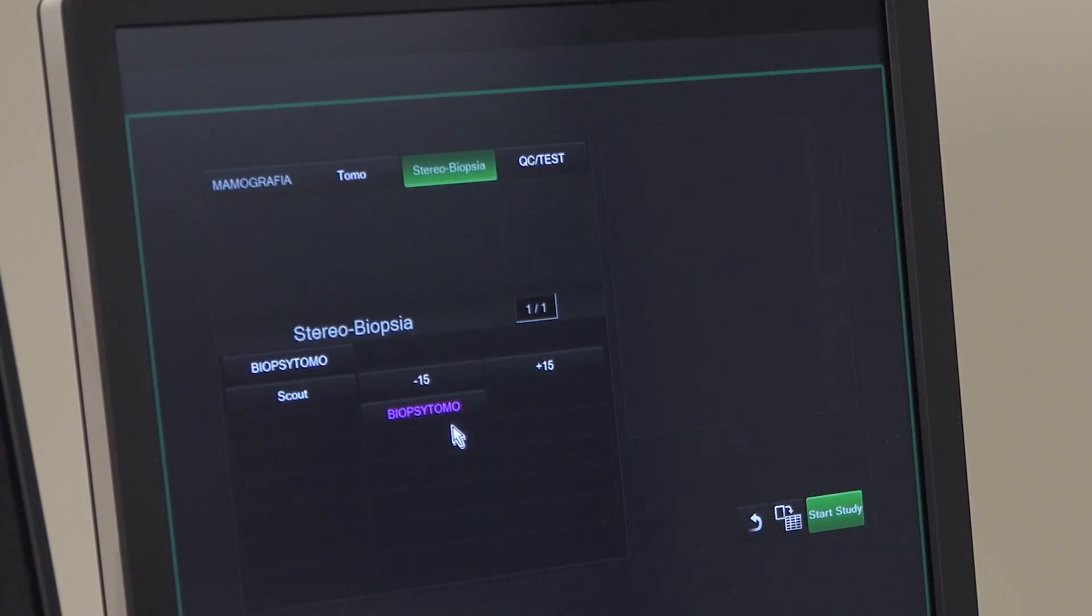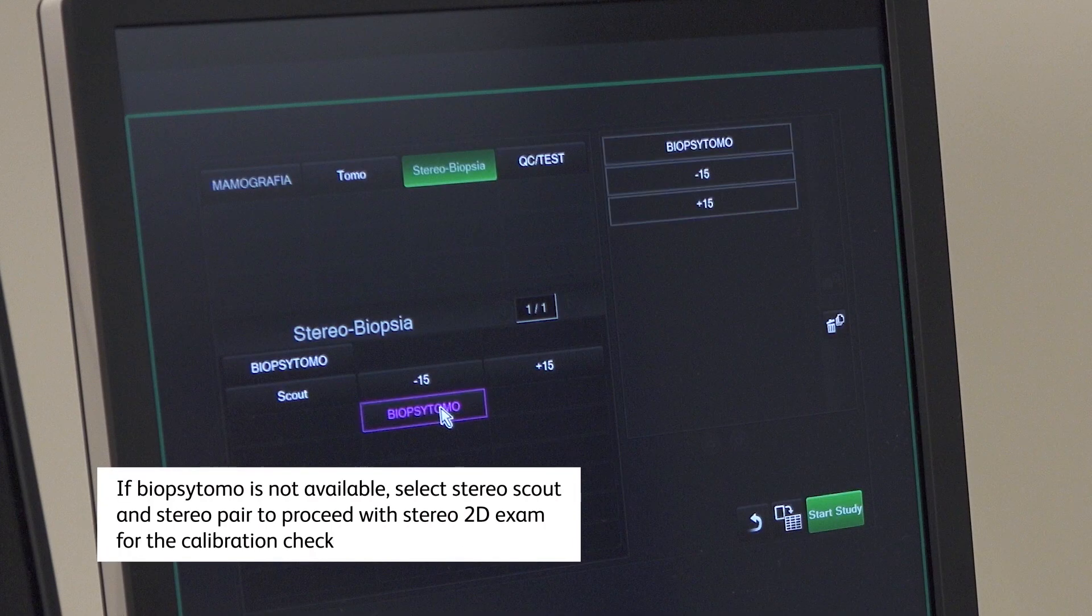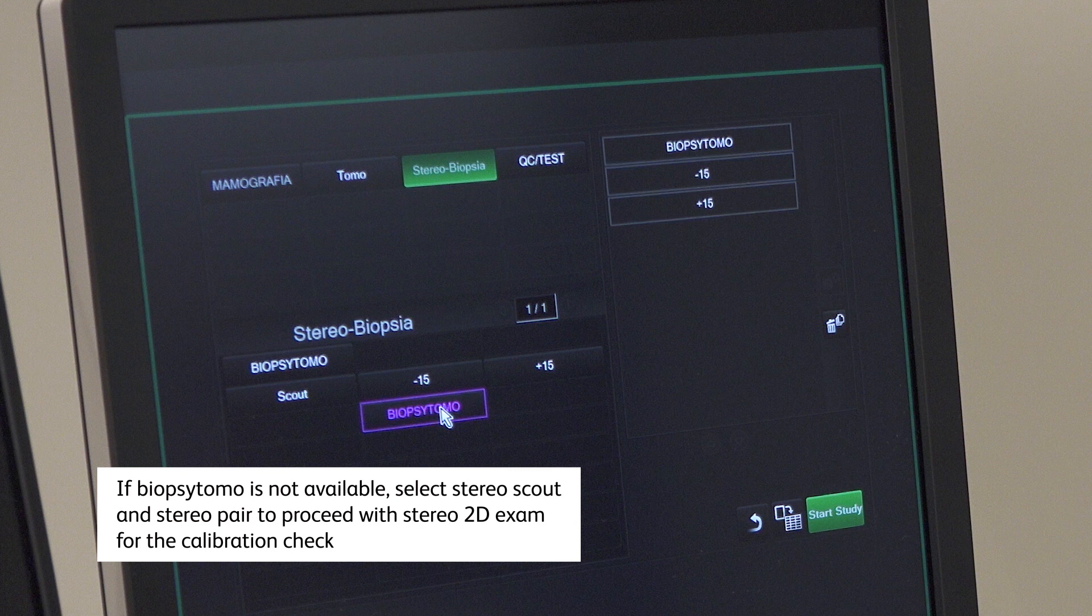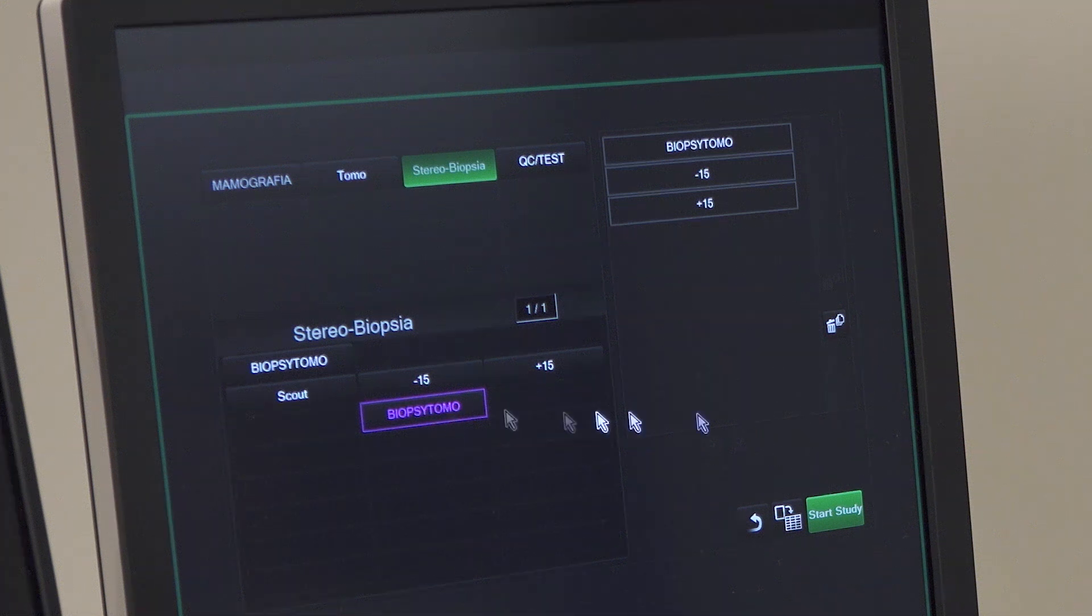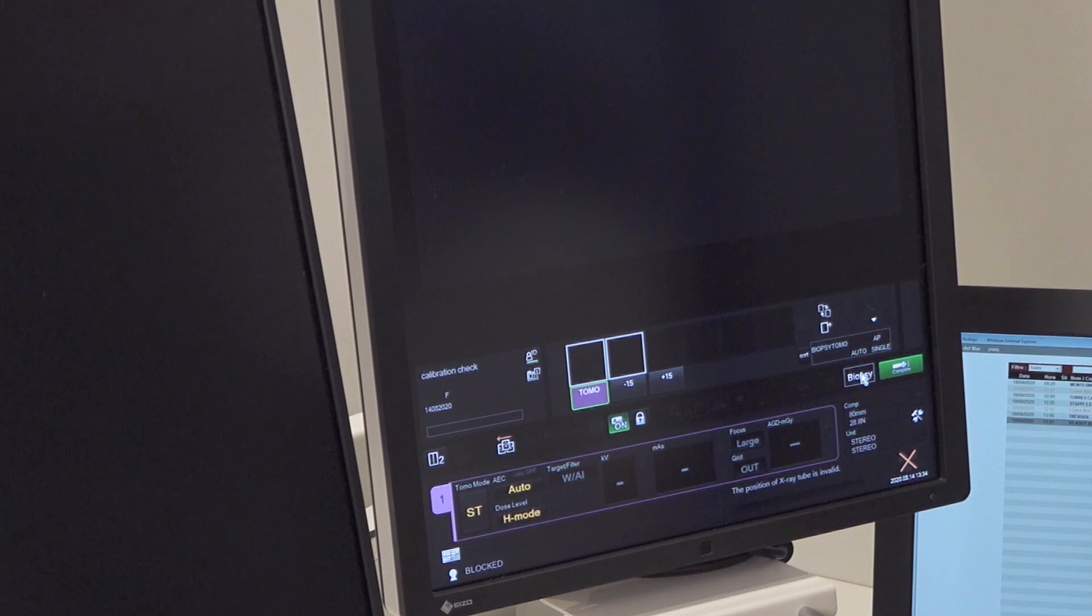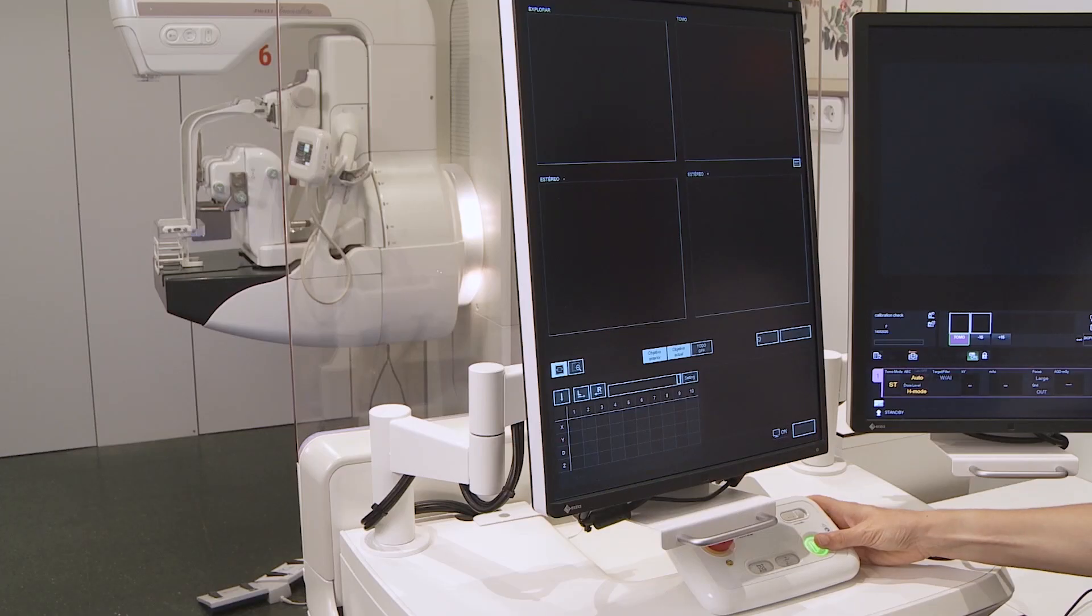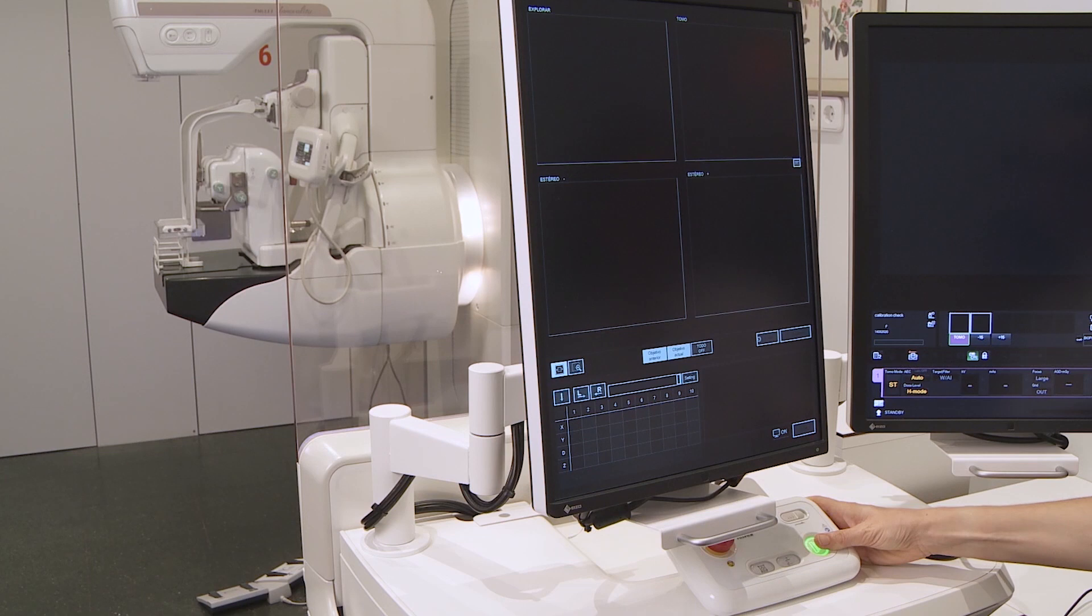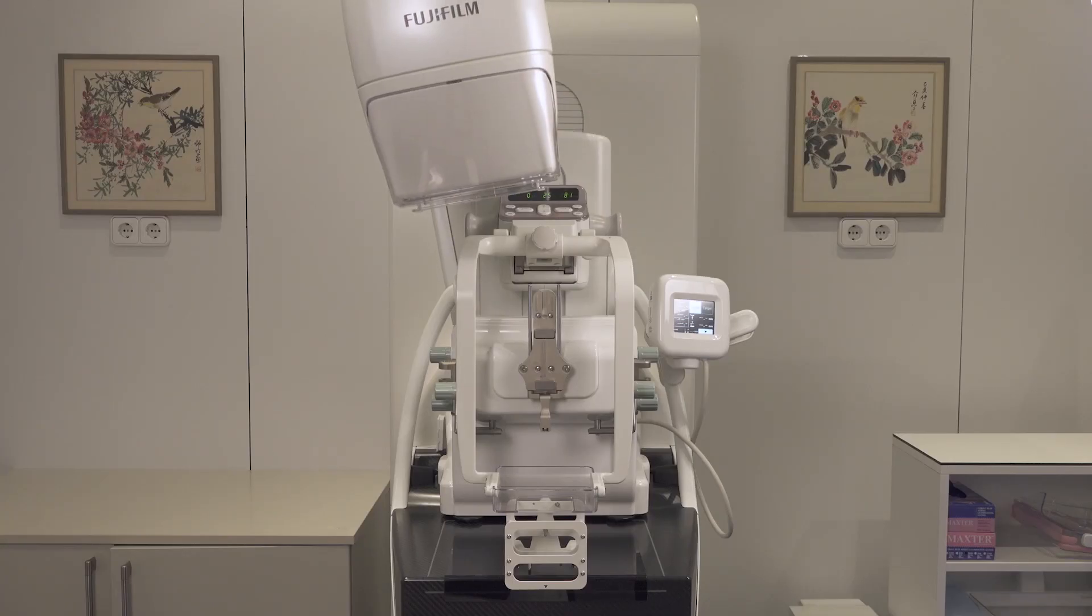Select a biopsy tomo exam. Once the study has started and the biopsy button has been clicked, the system is ready for exposure. Press the exposure button to complete the biopsy tomo sequence.